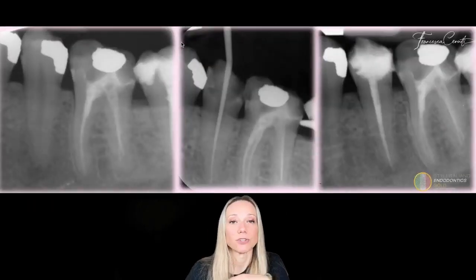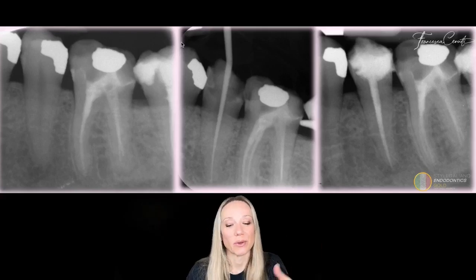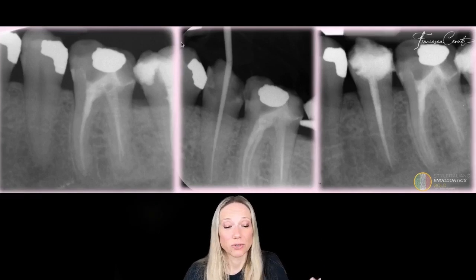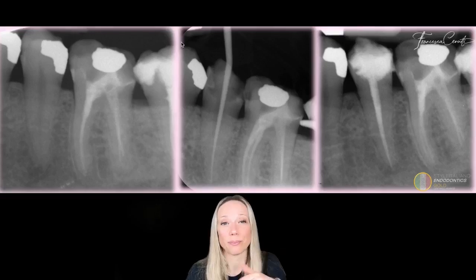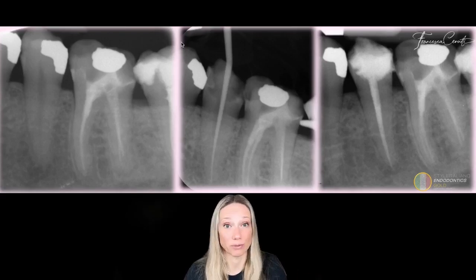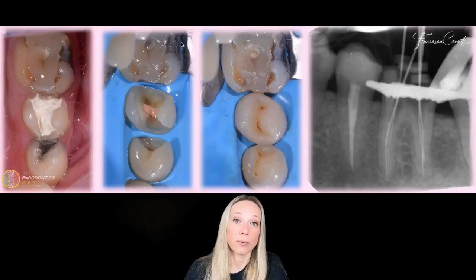And so in cases in which we have, for example, a treatment and a retreatment, what can we do? Well, more or less the same. We do the treatment first because it's symptomatic, the second premolar, and so I remove the pain from the patient because he arrived in an emergency appointment, and then I have to put a provisional restoration because I'm out of time. And in the second appointment, what do I do?